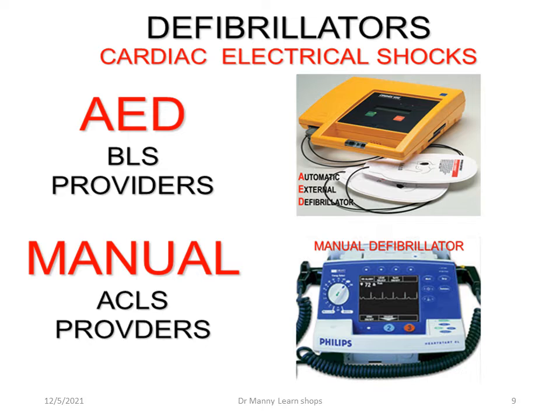When we look at defibrillators, these are devices that deliver an electrical shock to the heart. An AED, an automated external defibrillator, can be employed by BLS providers. The manual defibrillator really should be employed by advanced cardiac life support providers who have been shown and are skilled in using the device.